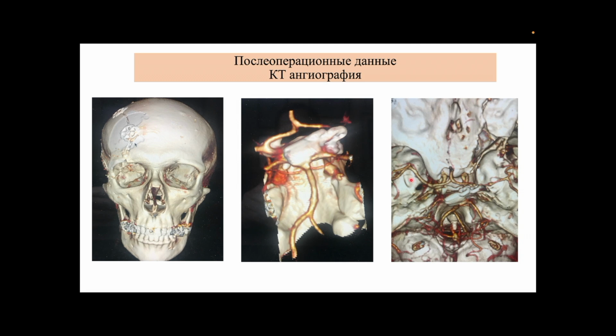CT angiogram shows good clipping of the aneurysm. Postoperatively, dysfunction of the oculomotor nerve occurs. The dysfunction was restored 2 months after surgery.